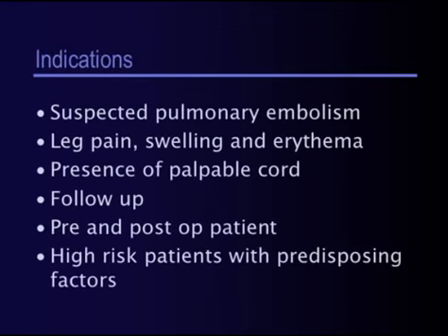The indications for the study: patients may present with suspected pulmonary embolism, or they may present with more local symptoms such as leg pain, swelling, and erythema, the presence of a palpable cord. They may present for follow-up to see if the thrombus is responding to therapy. They may order the study pre or post surgery, or in patients with high risk for deep venous thrombosis.